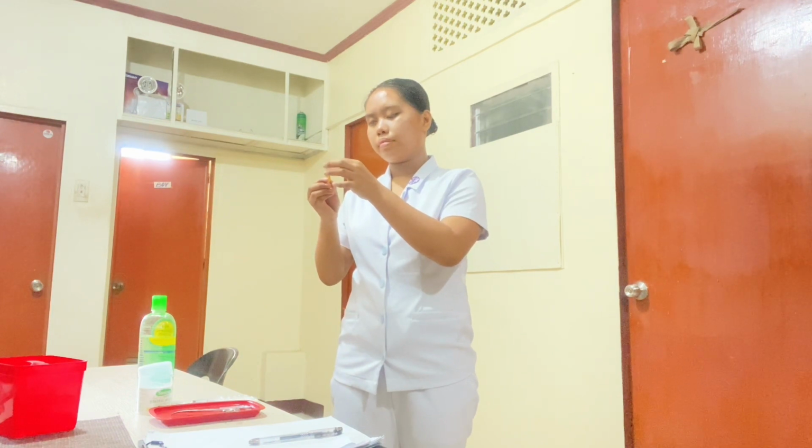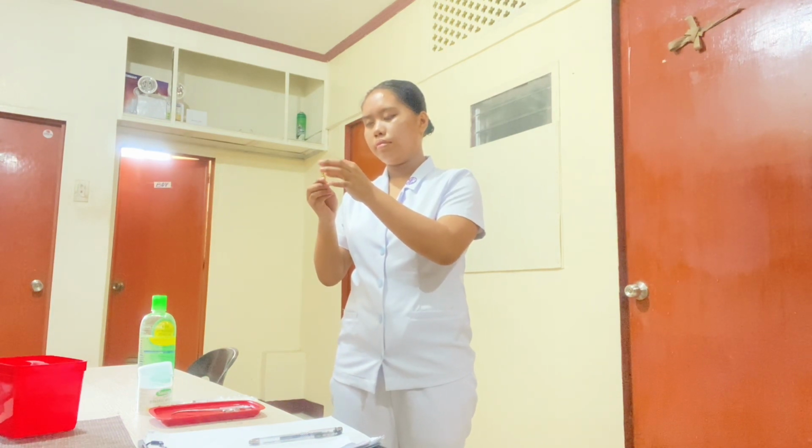And now, prepare the medication ampule for drug withdrawal. So, flex the upper stem of the ampule several times using the fingernails. Use the ampule opener, place a piece of alcohol wipe between the thumb and the ampule neck.